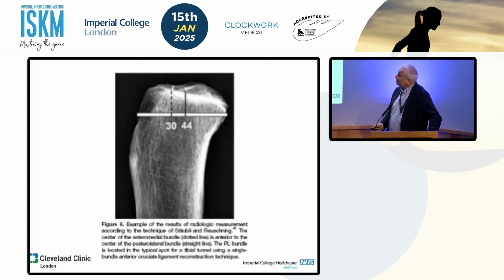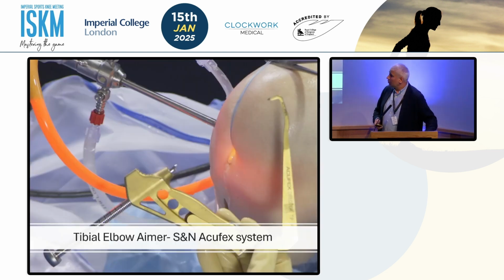On the tibial side, you want to end up around 44% along the border of the tibial plateau on your x-rays. So when you see your post-op x-rays, try and be consistent with evaluating your outcomes. I know some of my colleagues don't actually get x-rays after ACL reconstruction, but it is important to know where your tunnels are so that you can improve your technique as you go along.